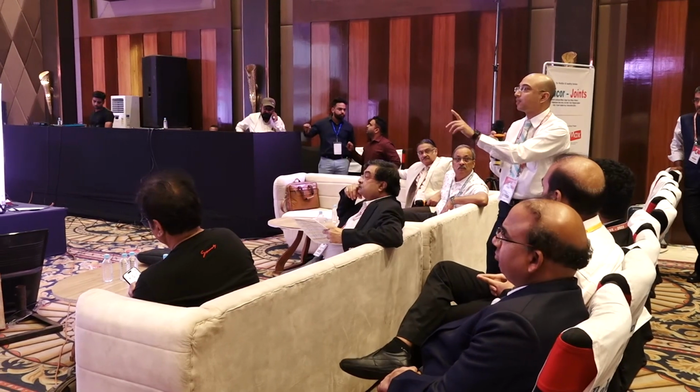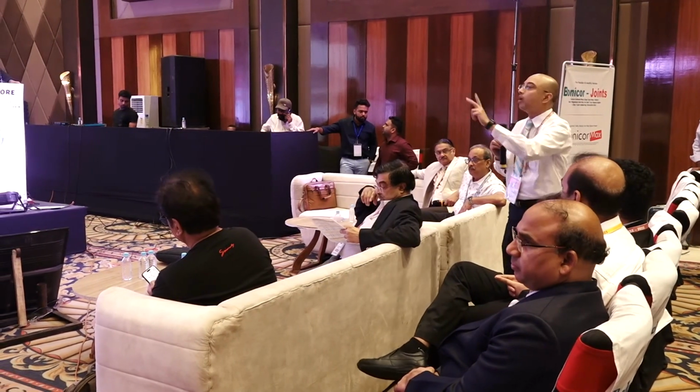We have not reached the point where 50% of the surgeons are using robotics. I think 10% or less of arthroplasty surgeons are using robotics, maybe 2%. So those who are doing normal, non-robotic surgery should at least start looking at the spine before the surgery, in standing and sitting, which will not be difficult. So that is the one message that we should give.